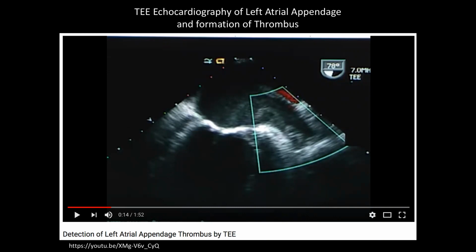So you can make whatever ROC you want. You just have to push it as high up on that rail as you can, as an engineer. Because you ask, okay, well, what's the downstream cost of a false positive? I'm going to call more people positive, and I might wrap up some people who actually don't have thrombus in there, and I call them positive. So what's the downstream cost of that?